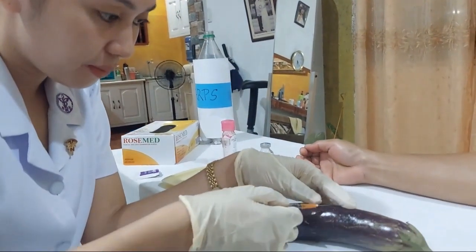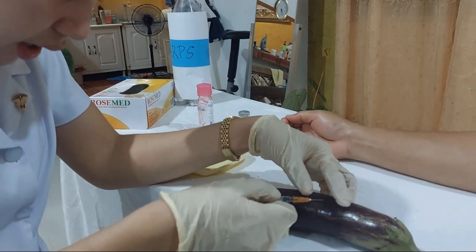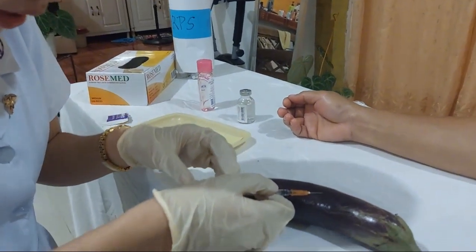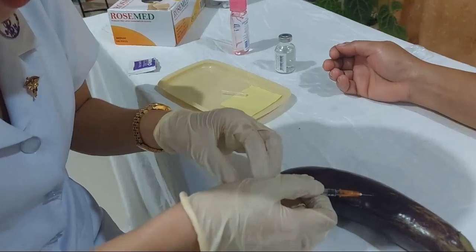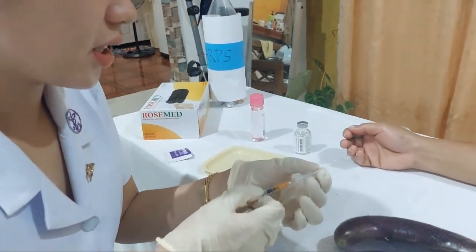So again, the non-dominant hand stretches and I inject, so that the dominant hand will not move, so it is stable. Then push the plunger and quickly remove the needle at the same angle as we have inserted it.